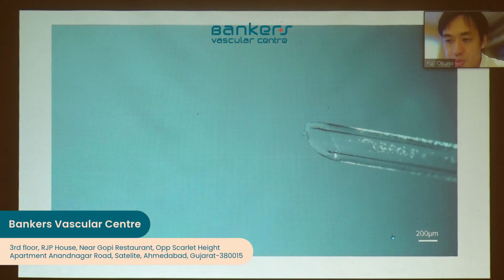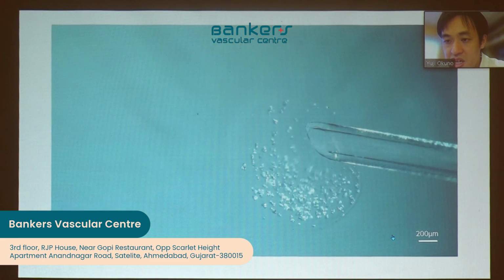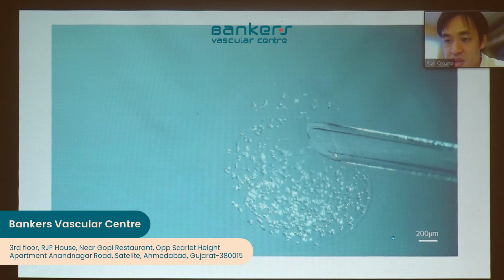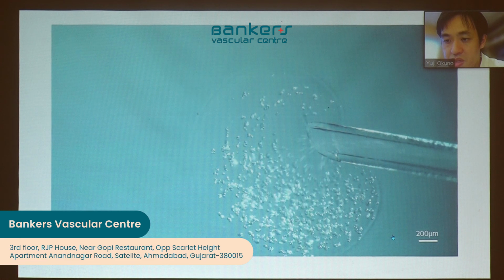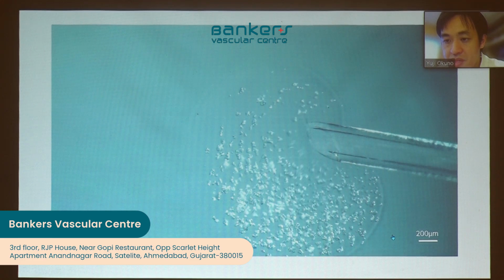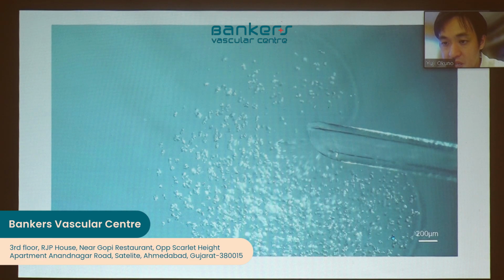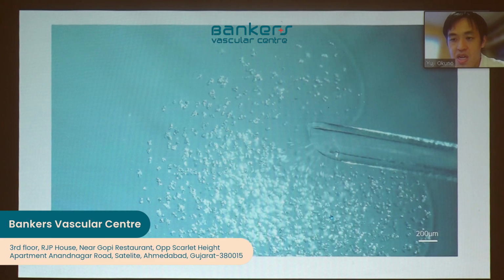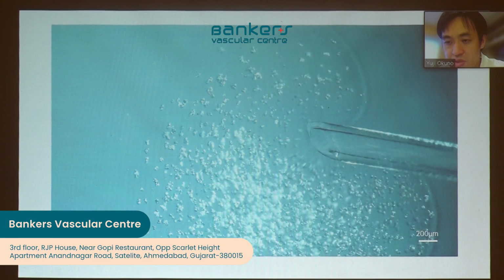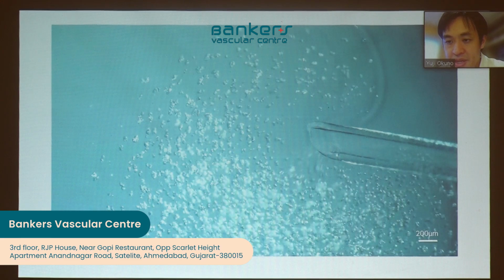This is a movie of this particle flushed out in the contrast. You can see the particle sometimes aggregates. Can you see this movie? I'm not sure you can see this movie or not, but yeah.